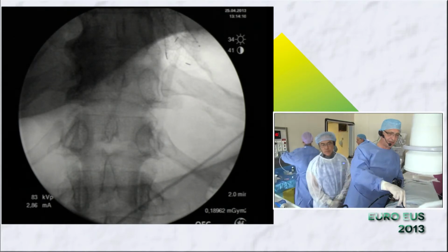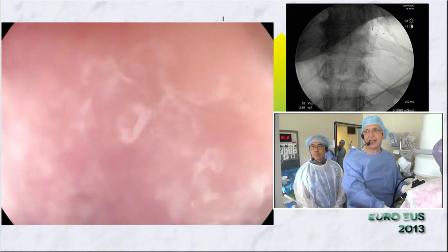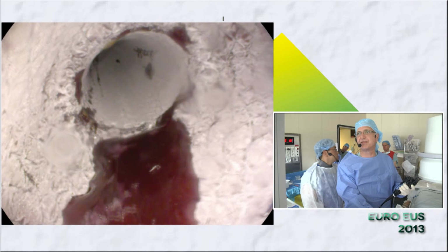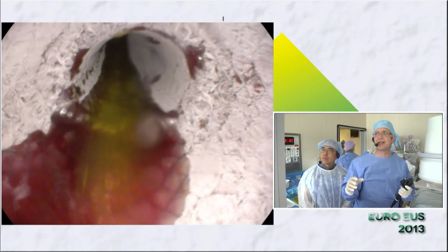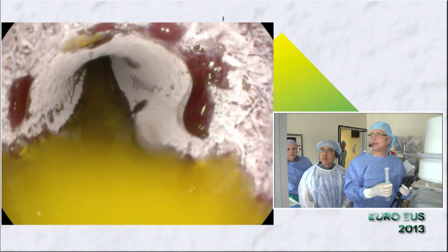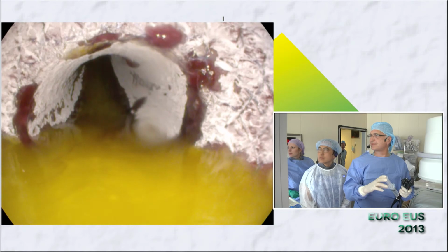So the coating of this Bona stent is made of polyurethane, and I think the coating is inside, which means that the meshes are outside and may a little bit prevent the migration. So this is the view of the stent from inside. You see that the coating is inside, very well visible. I would just recommend you at that stage not to try to go through the stent, because you may have a risk of dislodgement. Fluoro, please.